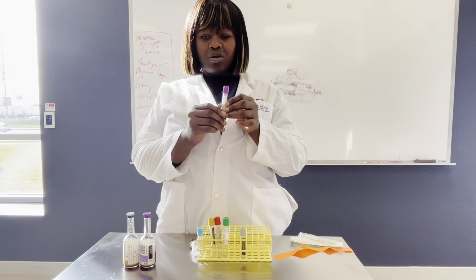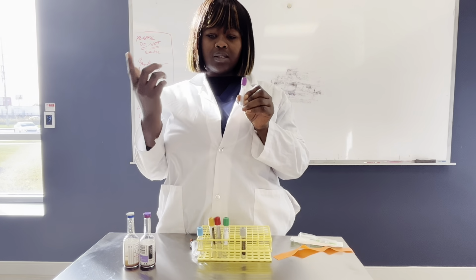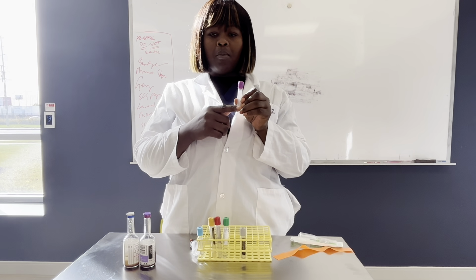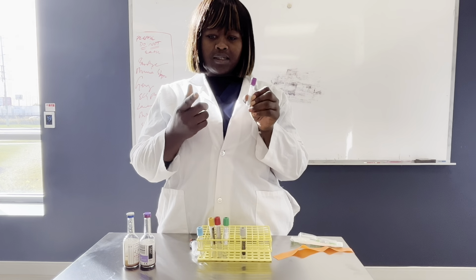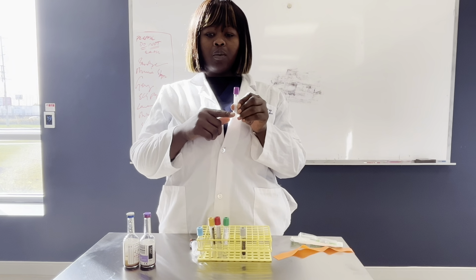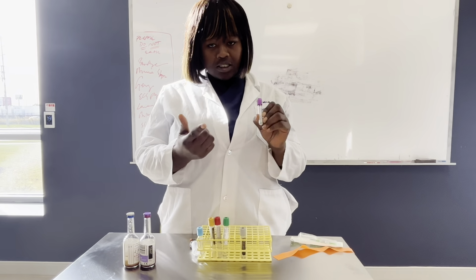But anyway, this tube is primarily used for hematology tests such as complete blood counts, otherwise known as CBC, and blood morphology evaluations. EDTA, K2, potassium EDTA, is specifically used to prevent coagulation by binding calcium ions essential for the coagulation cascade.